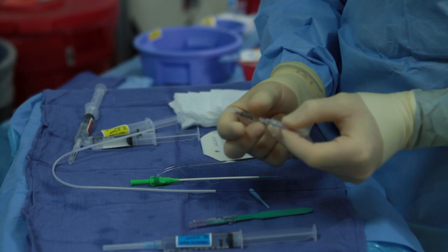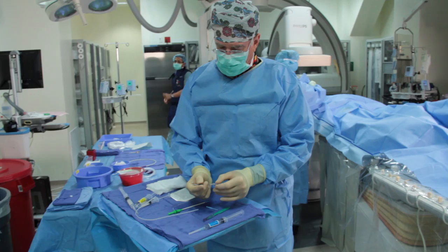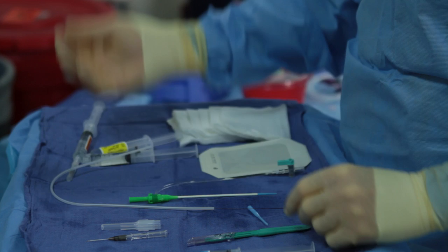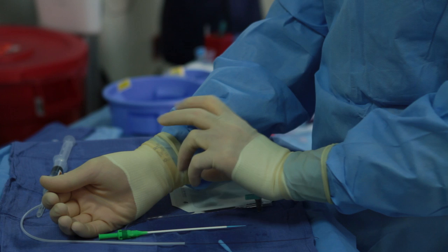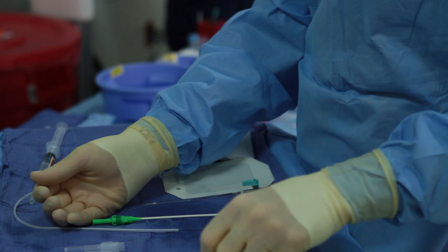What we'll be doing here — I can put this back together — we'll be accessing the radial artery about 2 to 4 centimeters from the tip of the radial bone, away from that so we can put the closure band right over the puncture site. We'll be giving a little bit of lidocaine superficially over that site.